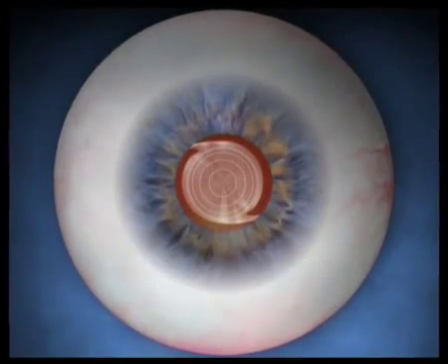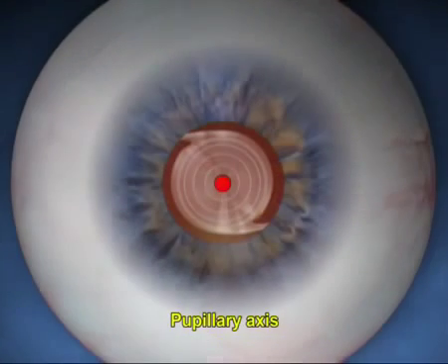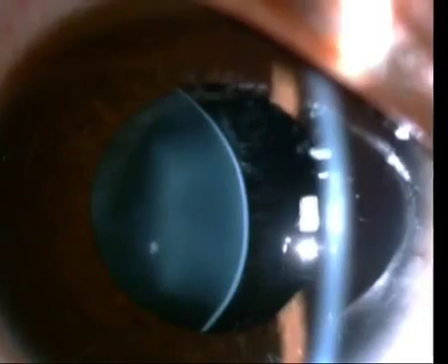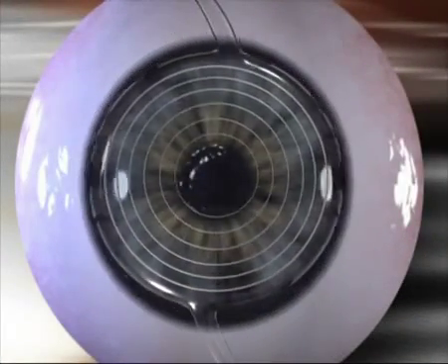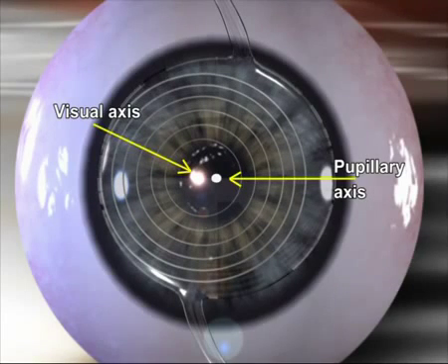Our study suggests that there may be an additional role of misalignment between the visual and pupillary axis in the occurrence of photic phenomenon after multifocal IOL implantation. In complicated situations, as well as, more importantly, in the routine multifocal IOL patients, it is important to take the angle kappa into consideration for IOL centration. Future advances might also include IOL customization to match the angle kappa of the patients, though post-op capsular contraction and IOL rotation would be challenges to be overcome.